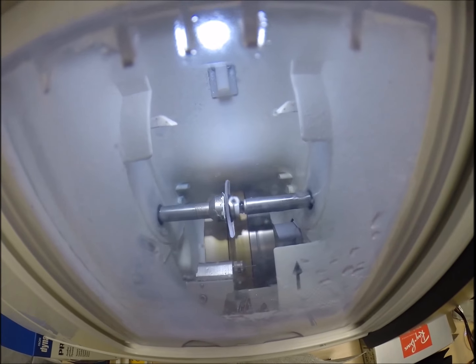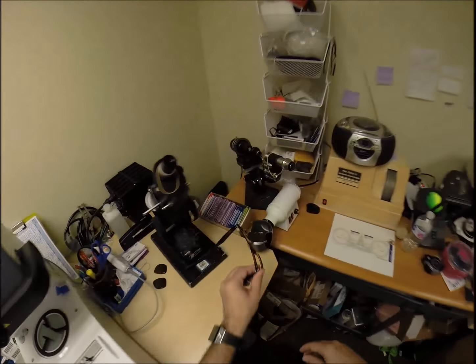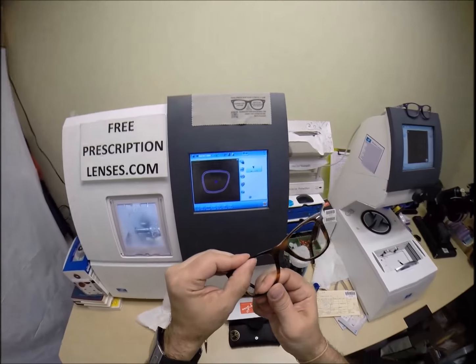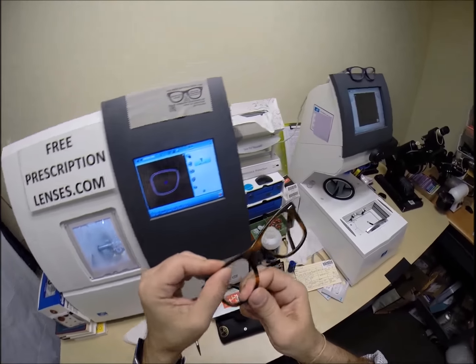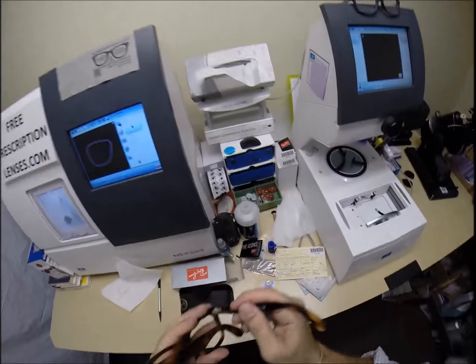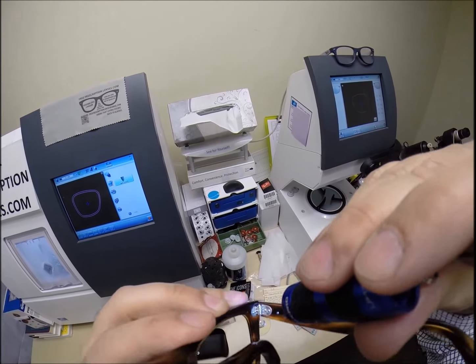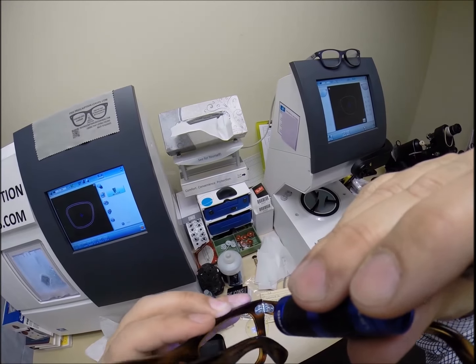But I want to be careful. I cold mount every lens. Some people like to heat the frame up to mount the lens. If the lens is too tight, it would cause the frame to stretch, although this is such a heavy-duty plastic. This has a triple barrel hinge. You could almost drive over this thing with a tank and not damage it.